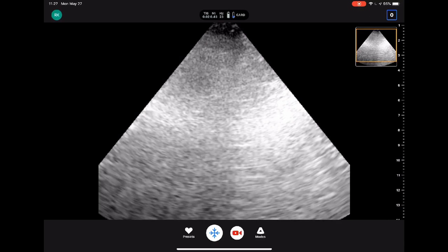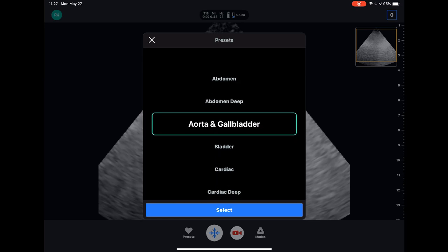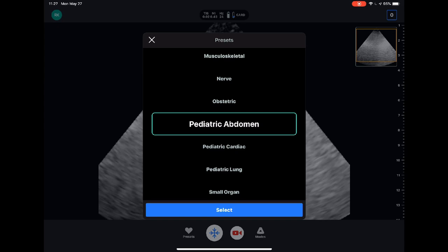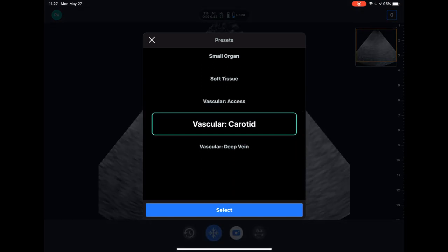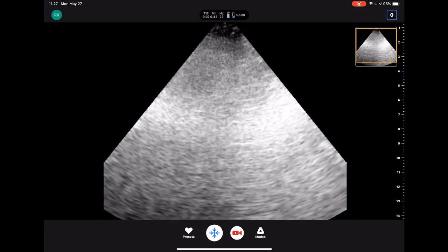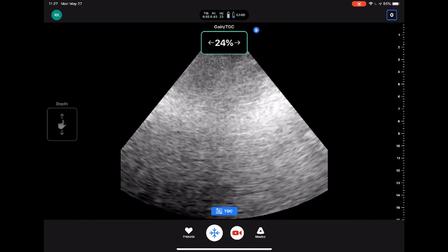Here's the Butterfly interface. The first thing you can do is change your presets to whatever you want — you've got a lot of different options. The beauty of this probe is it combines a linear probe, a curvilinear probe, and a phased array probe all into one piece of hardware. It'll automatically adjust based on the organ system you're trying to scan. You can also adjust depth with a two-finger gesture, and adjust time gain compensation at various levels by sliding your finger left and right at varying depths.